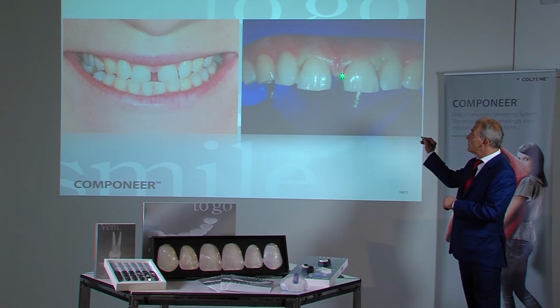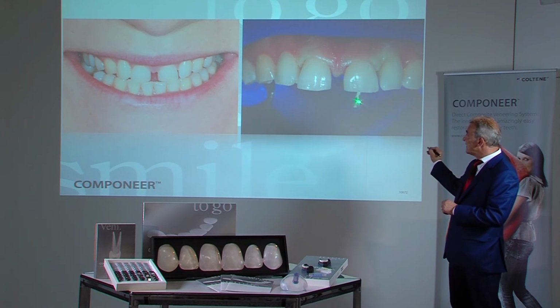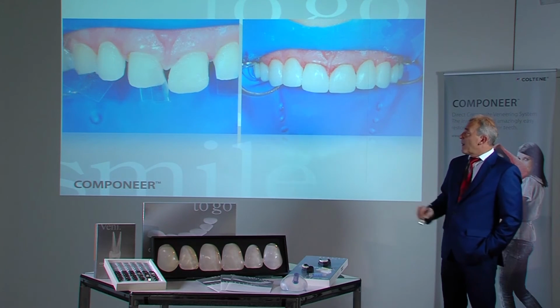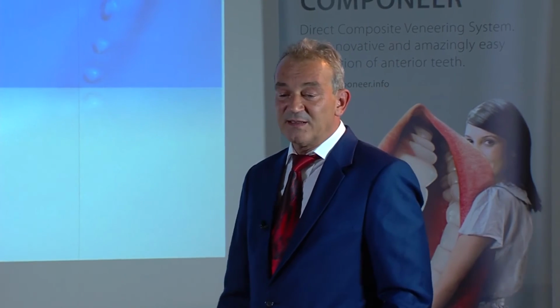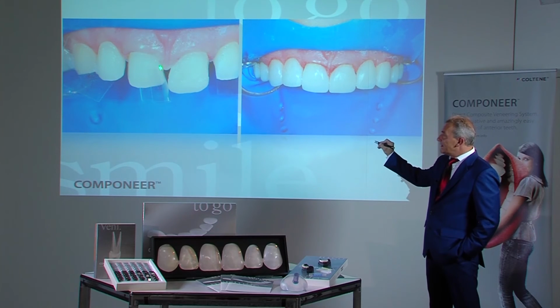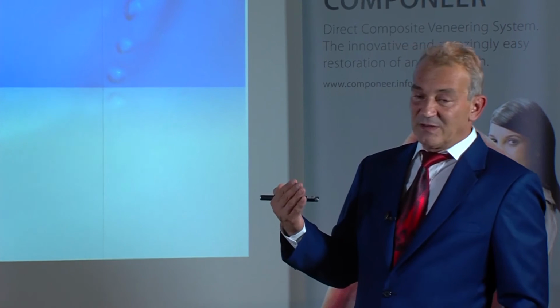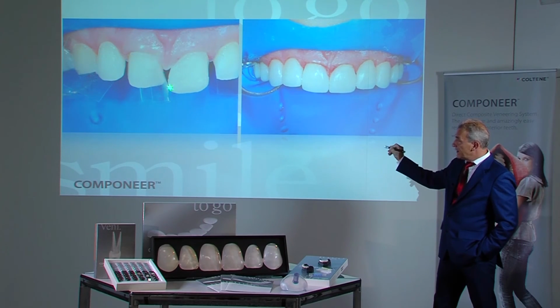It must be possible to place a retraction cord in this pseudo-pocket, this sulcus. Here we can see the retraction cord, which is somewhere at this level in the depth of the pocket. Why do we need this? To close such larger diastemas, we need a contoured molar matrix, in other words, a piece of matrix. One can cut this to size oneself. Contoured because we need a special cervical contour. We would like to achieve over-contouring of the tooth. This is rather difficult with a straight matrix, as this could only make a straight connection. The triangle would not be closed.